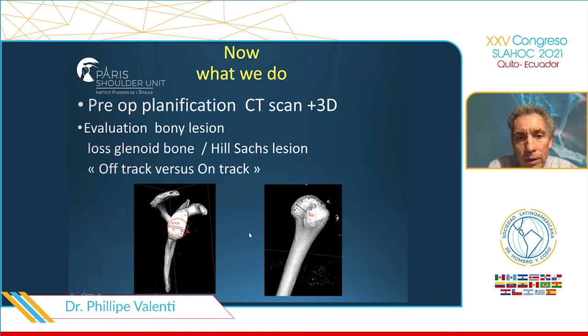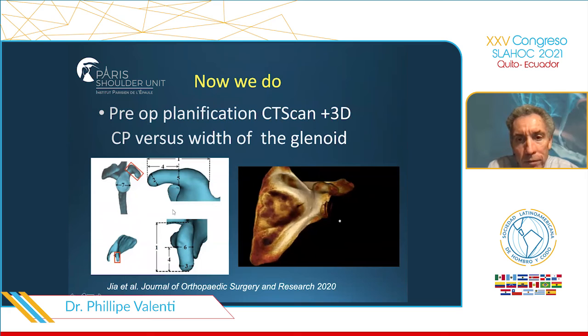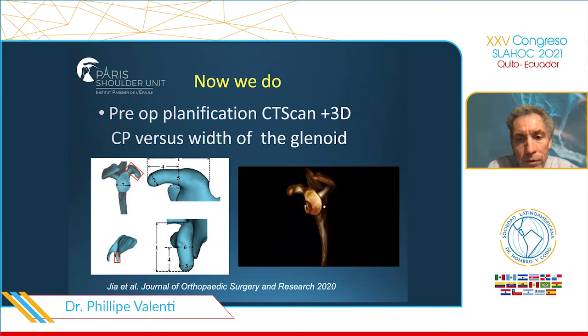Now, what do we do now? Systematically, I do a CT scan and 3D reconstruction to evaluate the bony lesion and the Hill-Sachs. It is important to evaluate the concept of off-track versus on-track for the indication. I do a preoperative planning to evaluate the size, the width and the length of the coracoid process, and what size we have to use. We now do a preoperative planning of the coracoid process systematically.